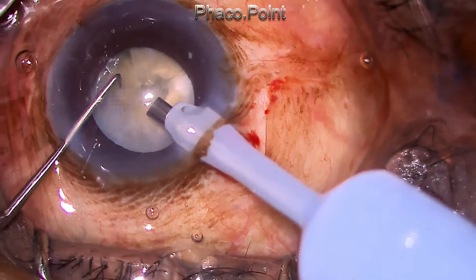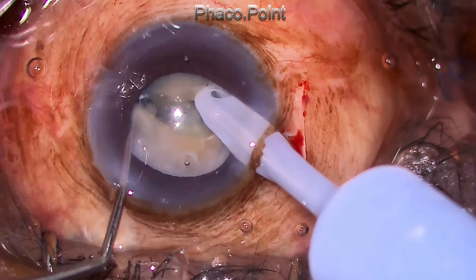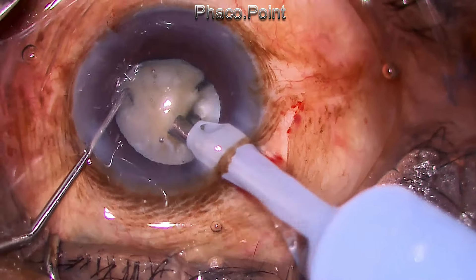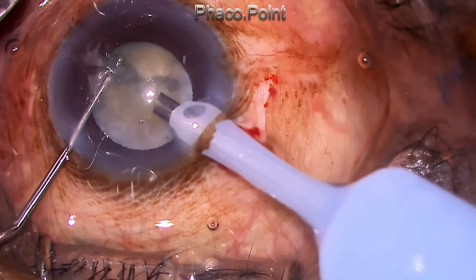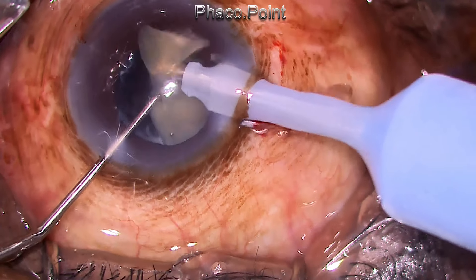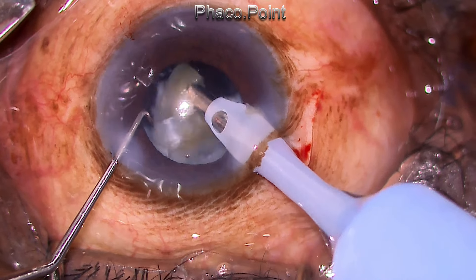This cataract is just turning hypermature. You can see the edge of the nucleus when you pull it towards the center, and that's where the crack starts. The nucleus in this case is not very hard or leathery — in fact it is quite chalky — and with just 40 percent power it's easy to break it down. The vacuum in this case is 300 mmHg and the bottle height is at 100 centimeters from the patient's eye.